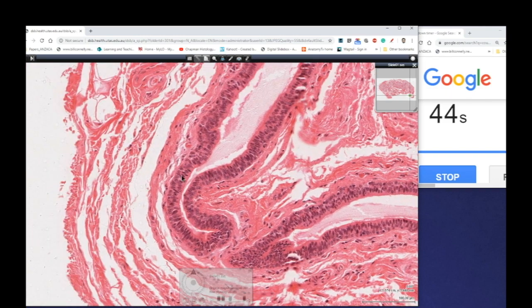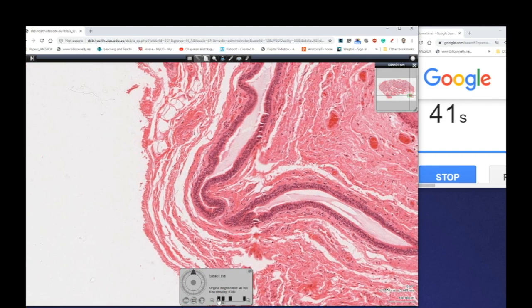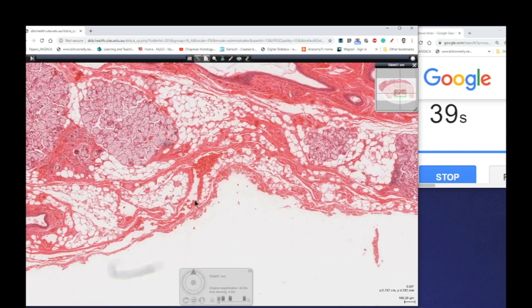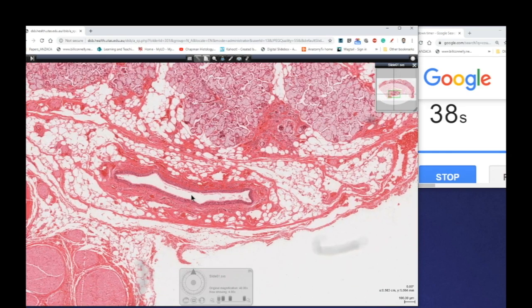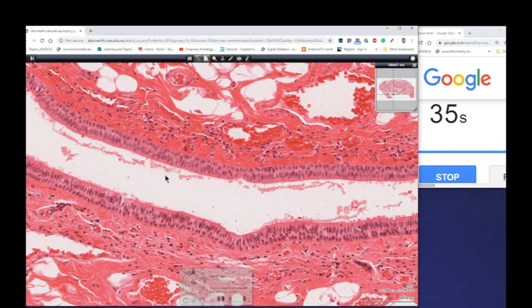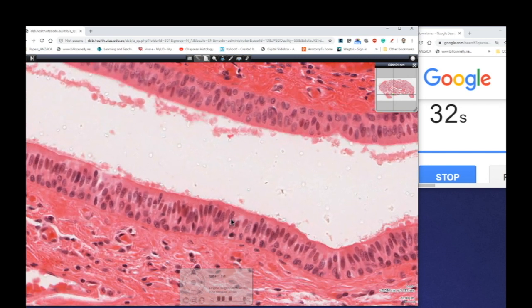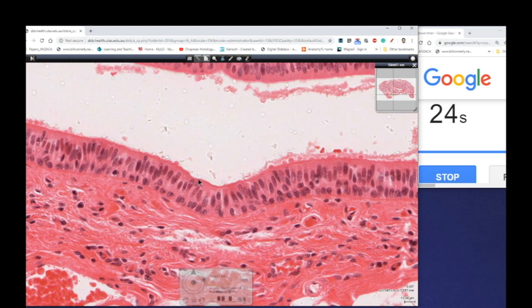These often start off as stratified cuboidal, then become stratified columnar. Oftentimes it is difficult to distinguish between the two. The difference that we use, of course, is the shape of the nucleus on the surface cells — they're either round, which means cuboidal, or they're more elongated, which indicates a columnar type of epithelium.